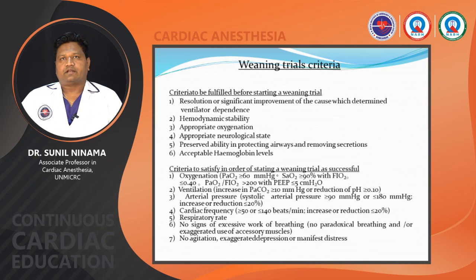There are weaning criteria, and you have to see how you can wean the patient from the ventilator. There should be resolution or significant improvement of the cause which determined the ventilator dependence. You have to treat the cause and then wean the patient from the ventilator. If the patient is hemodynamically stable, then you can wean the patient. If the patient has appropriate oxygenation and appropriate neurological status, then you can wean that patient. With preserved ability to protect the airway and remove secretions, then and only then can you wean the patient from the ventilator. An acceptable hemoglobin level is also desired.